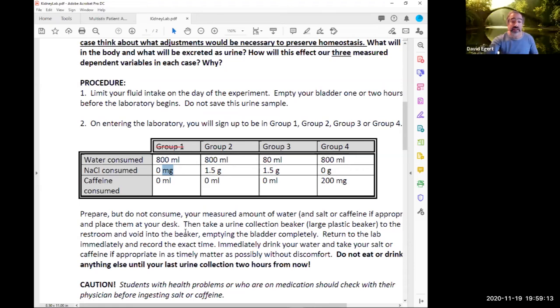Yeah, if I take more sodium in, I'm probably going to get rid of more sodium, right? Because to maintain balance. To be fair, this amount of salt is not that much. We used to do this with more salt, but then people would start feeling really uncomfortable. So if I lowered it lower and lower, this would be like eating a big bag of pretzels or something. It's not a crazy amount of salt.